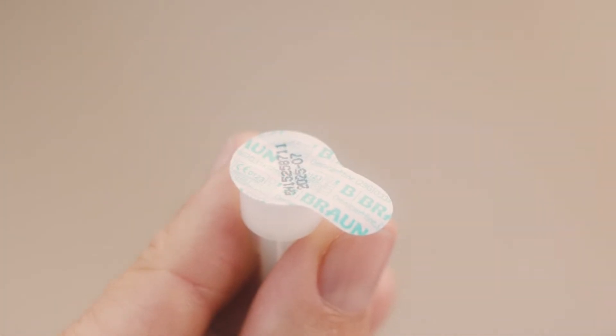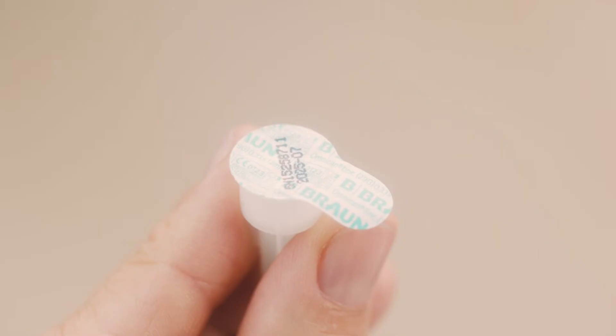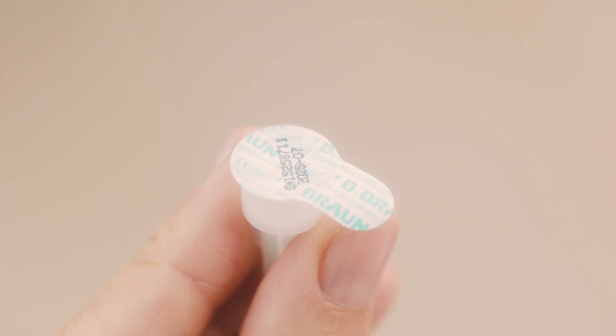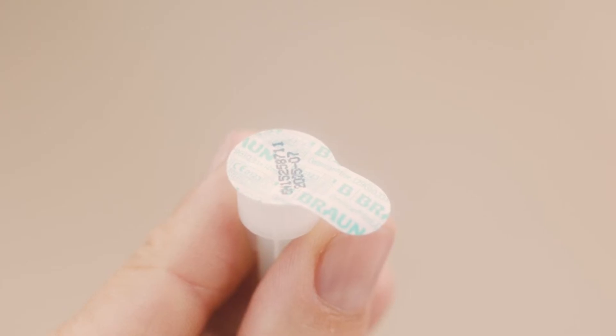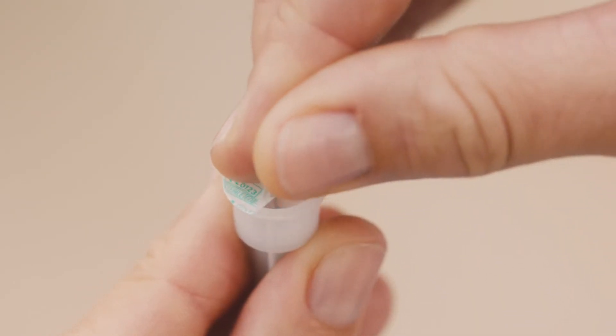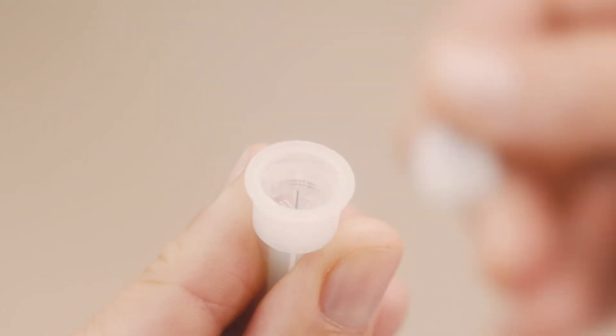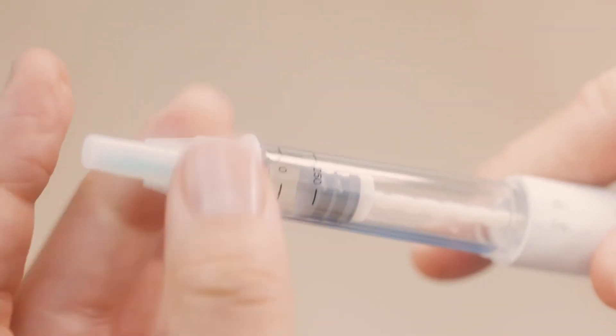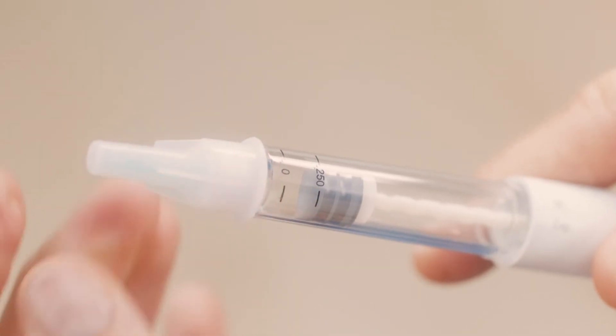Check that the seal on the outer needle cap is intact. If it's damaged or loose, do not use the needle — throw it away in a sharps disposal container and get a new one. Contact your clinic or pharmacist if you do need a new needle. If the seal is all okay, simply peel it off. Then put the threaded end of the pen into the outer needle cap and screw it in until it's firmly locked in place — not too tight though, or it might be hard to take it off again.